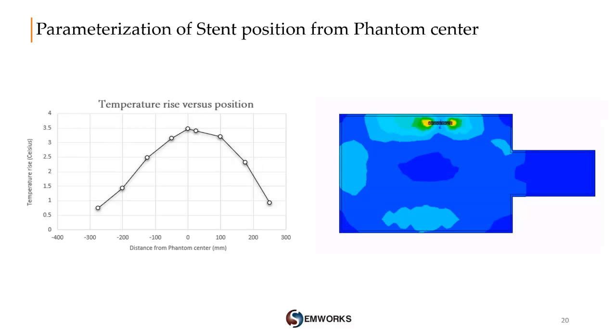With the same stent device, the HFWorks tool also allows us to predict the effect of the stent position inside the phantom using a parametric analysis by changing the distance from the phantom center to the stent center. We got the following results.